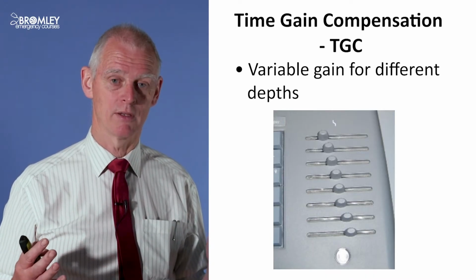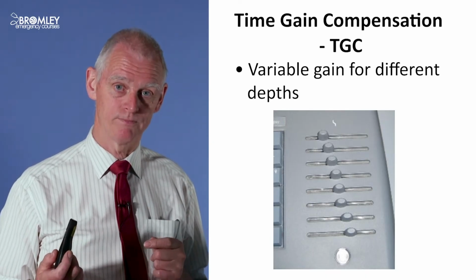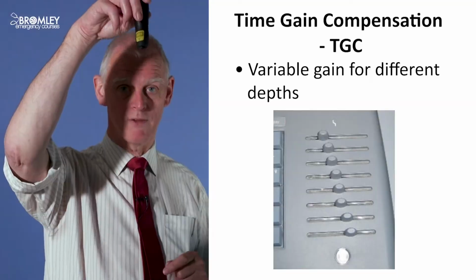What's the TGC about? Well, to understand it, we have to talk about attenuation. So I think you'd agree with me, if I put a probe on the skin, and here's the skin, and send a beam into the body, it's going to get weaker as it goes into the body, isn't it?